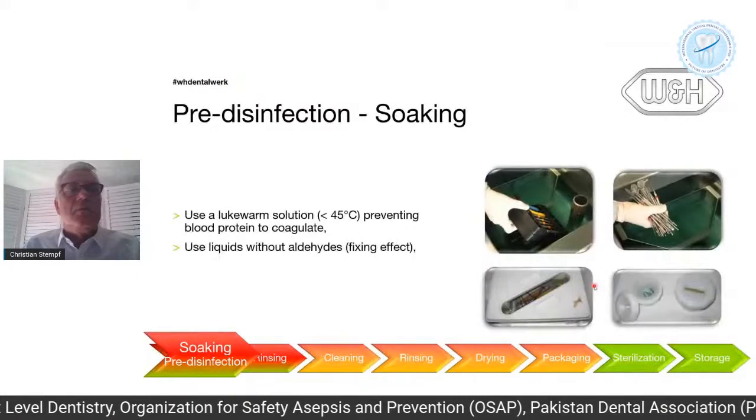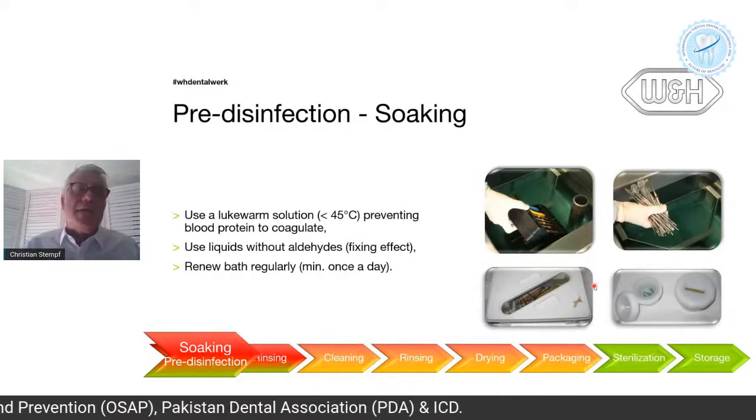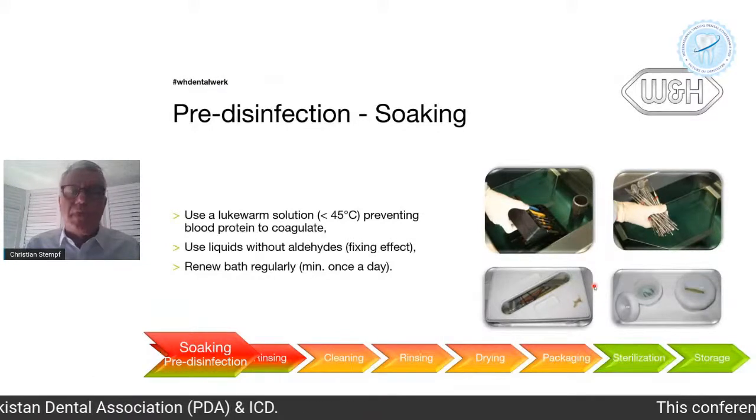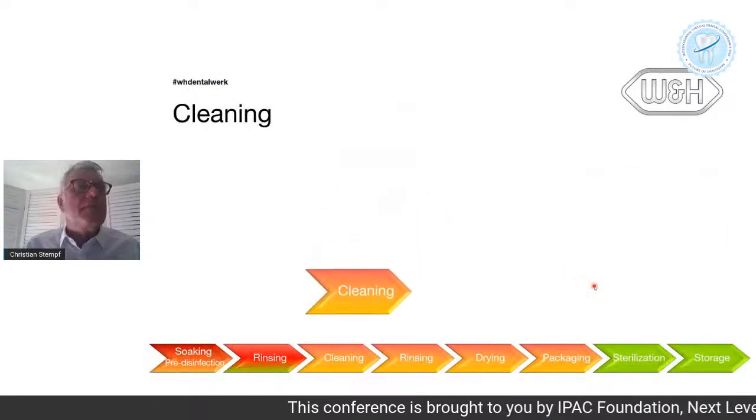Okay, so don't make it too hot. It should be lukewarm. Avoid liquids with aldehydes. They also fix the blood proteins. I'm going to rush because I have time left.